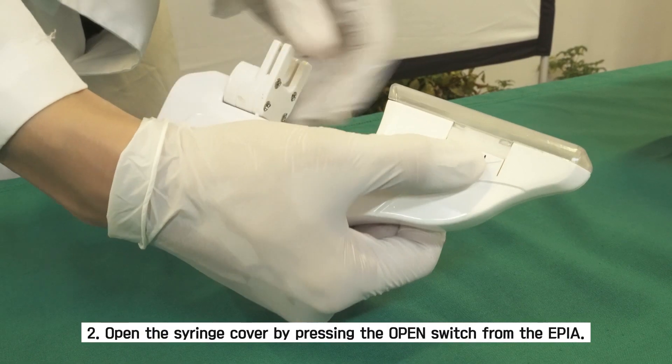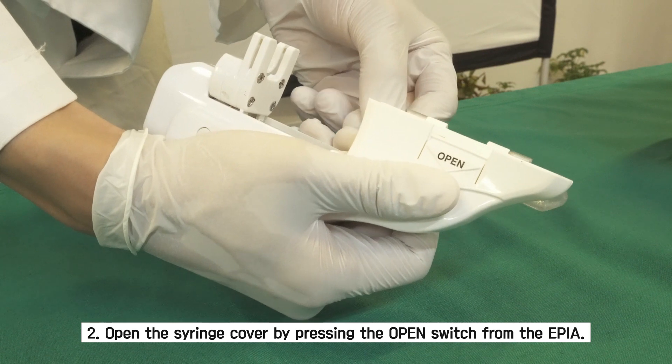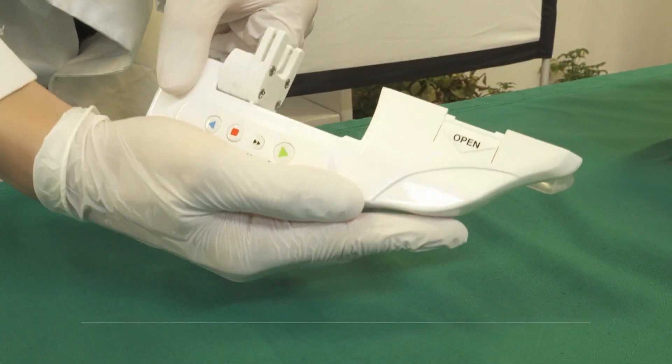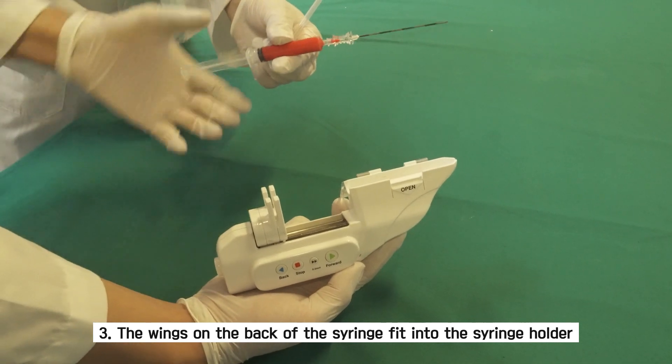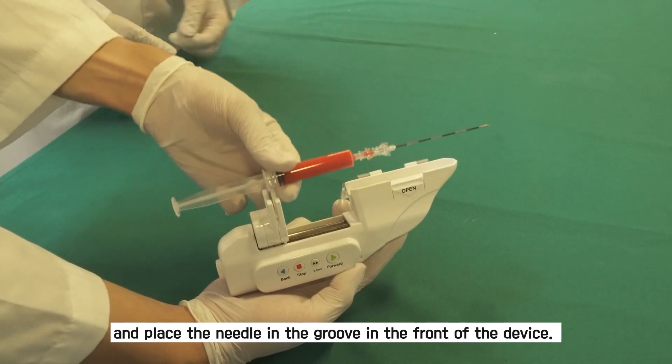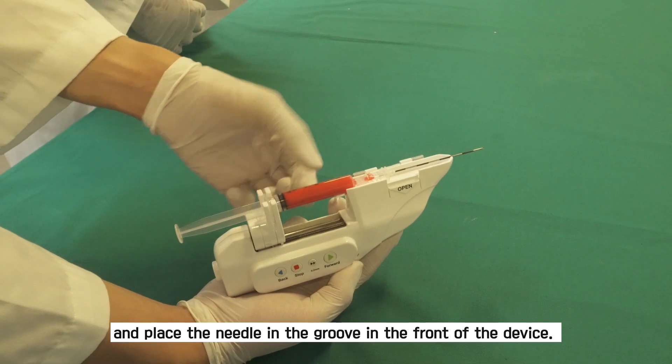Second, open the syringe cover by pressing the open switch from the EPIA. Third, the wings on the back of the syringe fit into the syringe holder and place the needle in the groove in the front of the device.